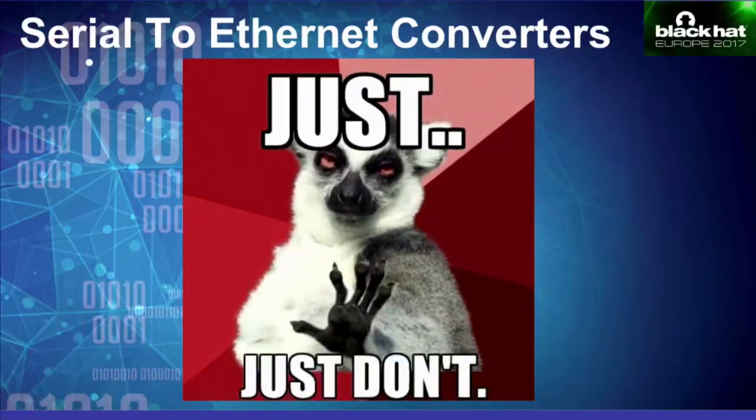Another allowed an attacker to remotely connect to the device and upgrade or downgrade its firmware without any authentication. A third allowed attackers to remotely execute malicious code on these devices simply by connecting to them, without authentication, because there was a buffer overflow vulnerability.